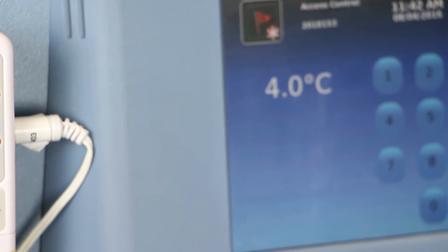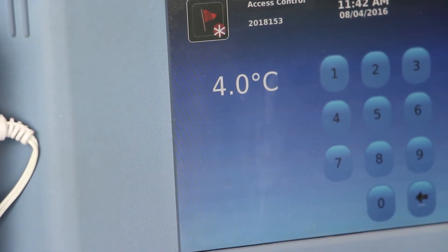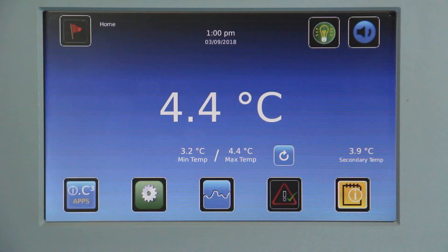If the independent thermometer corresponds to the display temperature, you can stop the video here — no further action is needed. If they do not correspond, we can adjust the display temperature to match the calibrated independent thermometer.